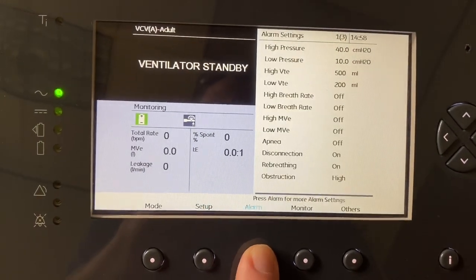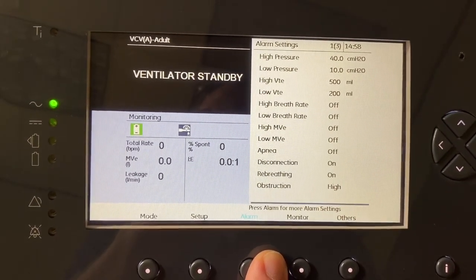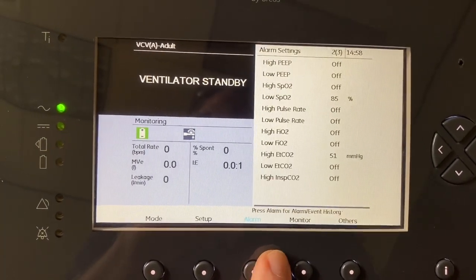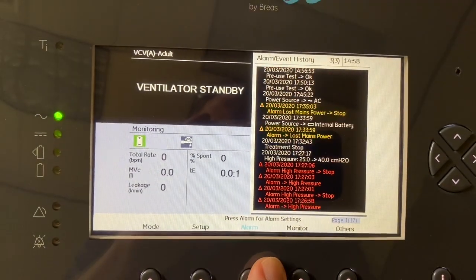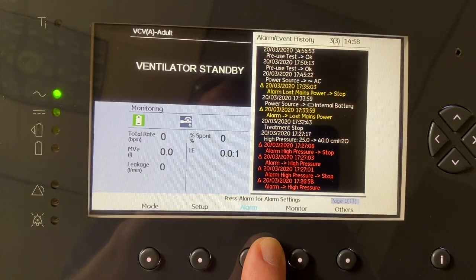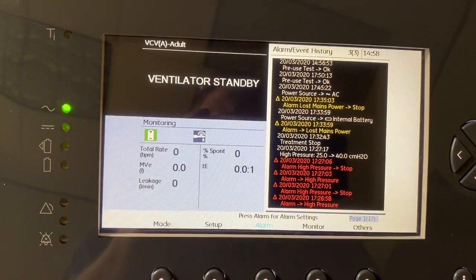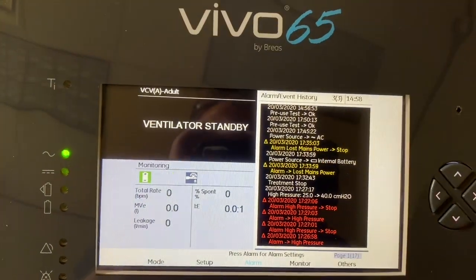Press alarm to adjust your alarms. You have your different alarm parameters you can choose. Press alarm again and that takes you to two more options. Press alarm a third time and that takes you to an actual event history, so you can see prior alarms that the event had. You can also see the pre-use test that was just completed earlier.